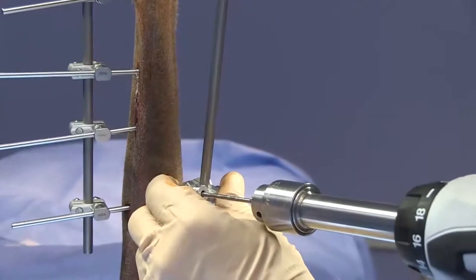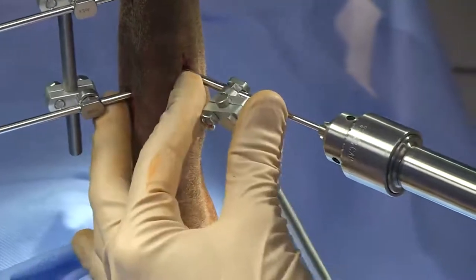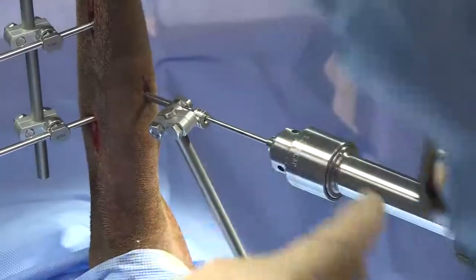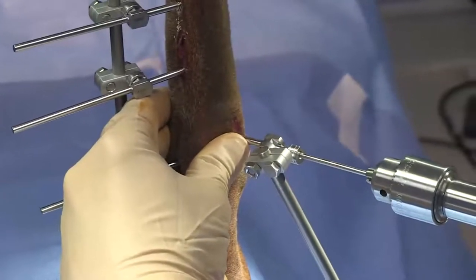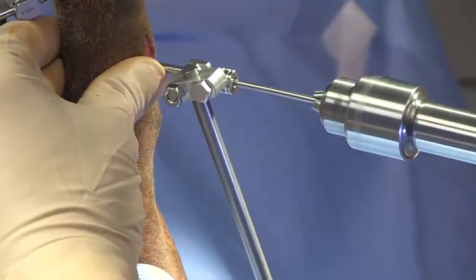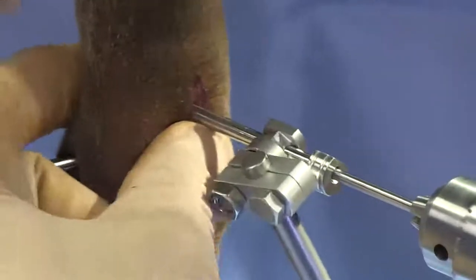Take a step back and assess the alignment of that drill — make sure you're happy with the plane. Again, we're aiming for a cranial lateral plane. I'm going to inch off the bone a little bit until I'm happy with my orientation. I know my drill is not going to engage the opposite pin, and I'm happy with the cranial lateral plane I'm establishing with this pin. We'll go ahead and fire our drill hole — and we've exited the opposite cortex.